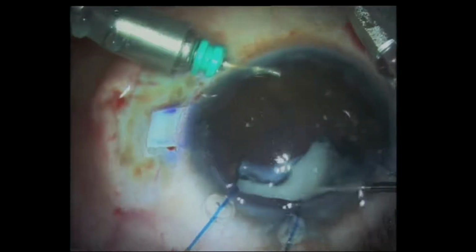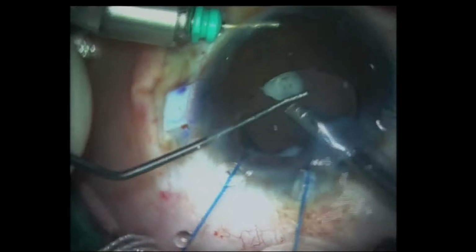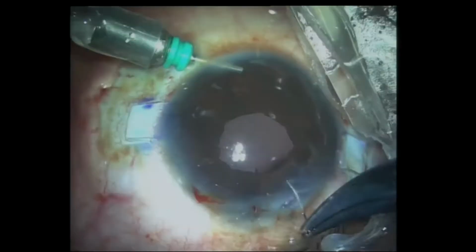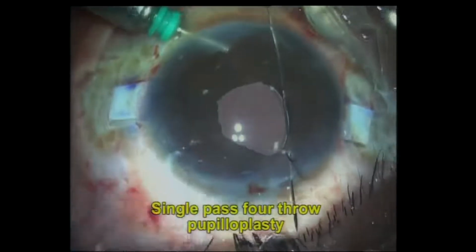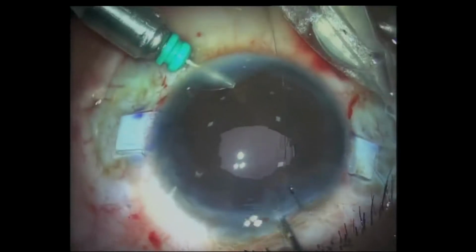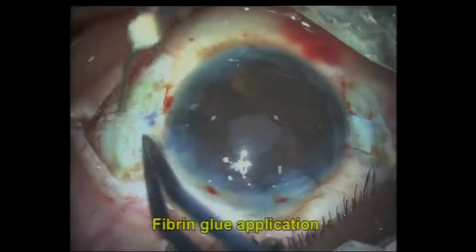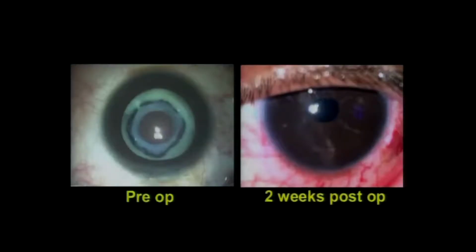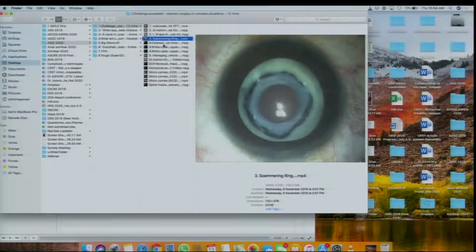Now this piece, the last piece over here, if you see, is invariably very large. So you actually have to use a phaco probe to do it. You cannot take this off with a cutter. You cannot take this off with any other instrument except a phaco probe, which can be done in 30 seconds or less. Vitrectomy is possible, but you have to chew up the pieces, and the pieces invariably fall down without doubt. Again, doing a pupilloplasty invariably helps prevent an optic capture, and that's something that you really don't want in these cases.